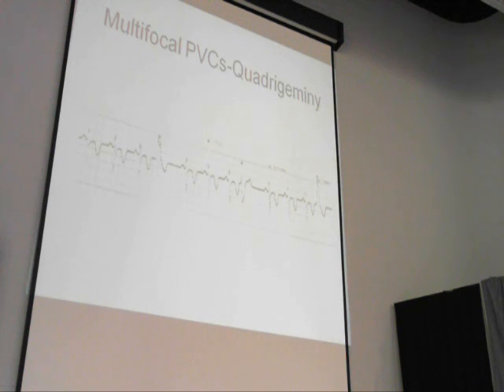Irritability, excitability. Not all excitability is in the cardiac cells. So say somebody's got some coronary artery disease and they have PVCs. How do we know what a PVC is compared to everything else we're looking at? What characterizes a PVC?